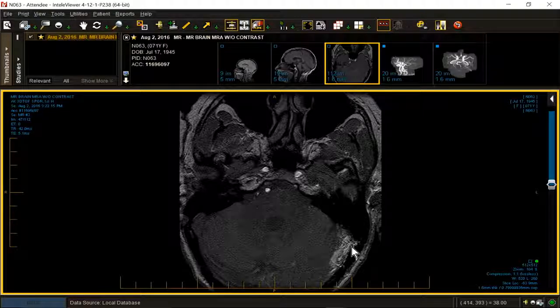So let's talk about these a little bit, because they're often missed, and they are often missed in the spine, where you're going to see some in the spine section. The misses are catastrophic in the spine. 80% of all radiologists that I've ever encountered, no offense intended, have missed a dural AVF on more than one occasion. Typically, I am seeing the 6th MRI of a man who has paresis that is ascending with a sensory level. And the diagnosis is made at that point, and it's too late.